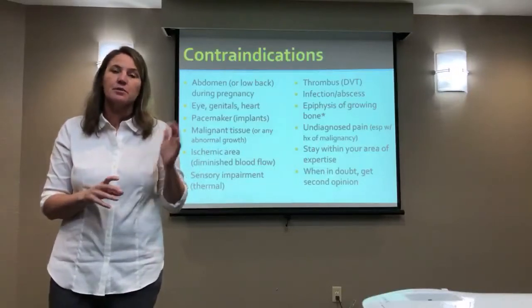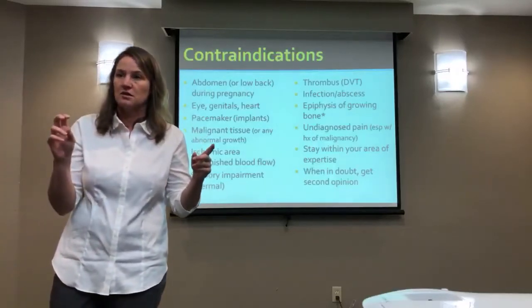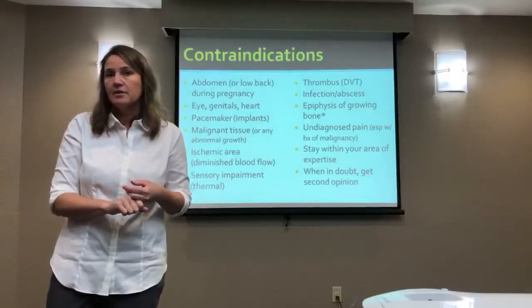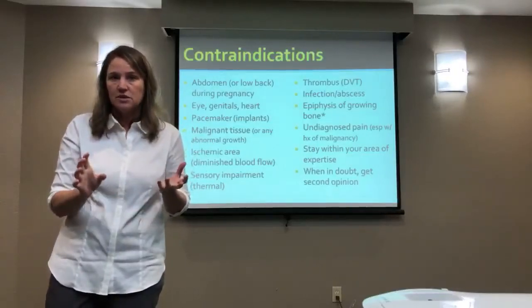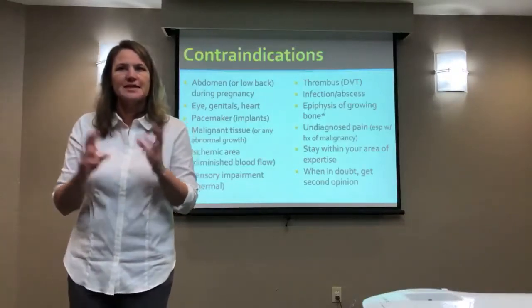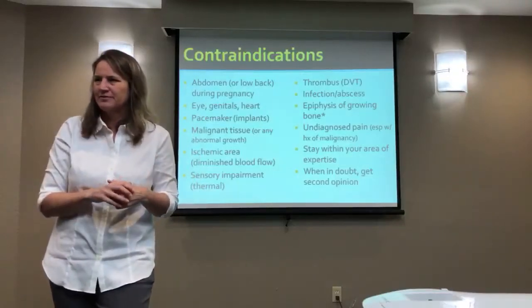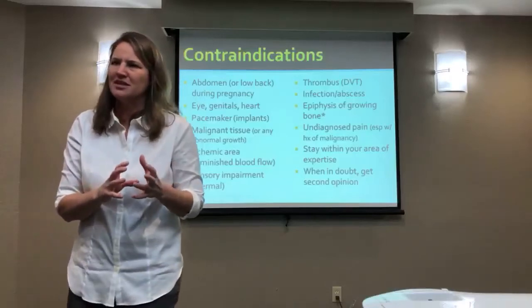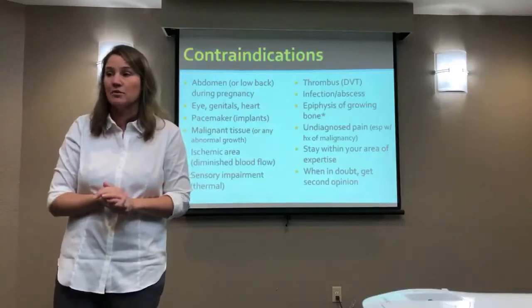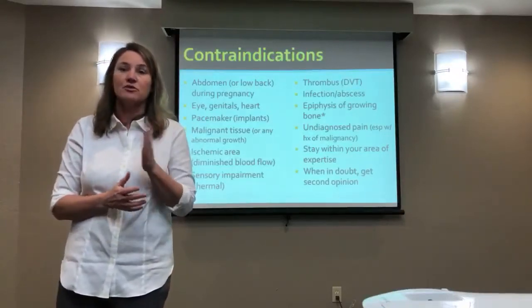Now, if they have some blood flow issues, meaning they have a diagnosis of peripheral vascular disease, but they have good sensation, you've tested their sensation, their sensation is not impaired, arguably you could do ultrasound. It would be a precaution, I would be cautious, but their safety net is there. They could say ouch if it gets too hot. That's why when the doctor talked about the severe damage to a muscle, it's just hard for me to imagine that could happen. I don't want to say it's impossible, I don't know what he saw, but it just seems very, very unlikely you could ever harm somebody, assuming they have good sensation.